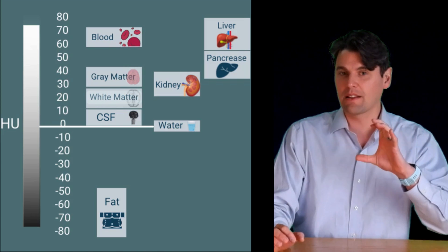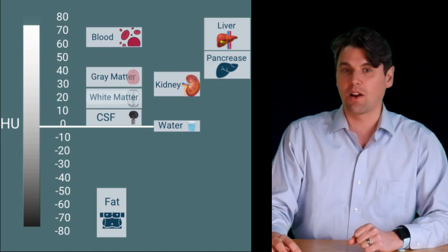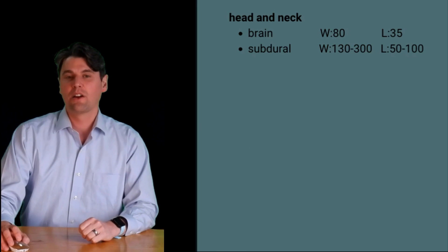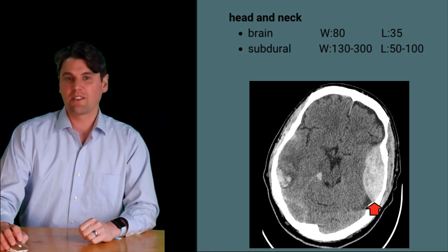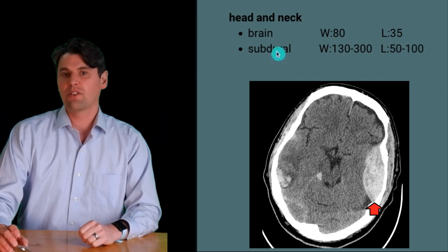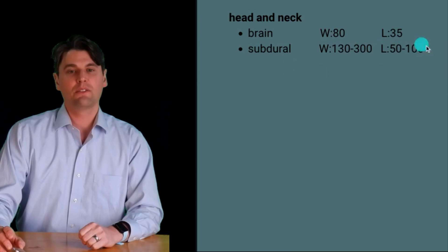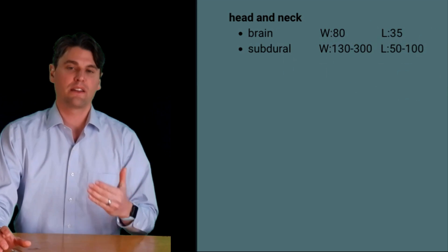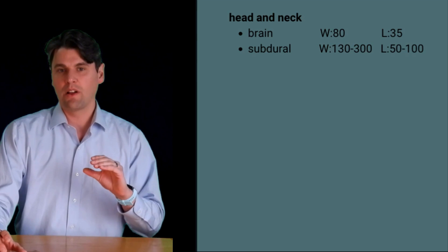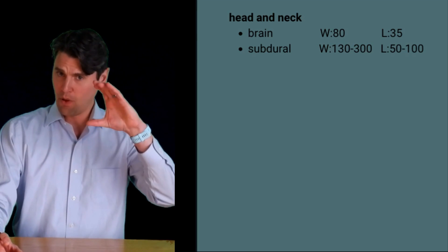You need a special window for imaging blood in the brain, especially if it's along the bone interface or right next to the calvarium, because you wouldn't want to confuse blood and bone when both are saturating out. This is called the subdural window — you make the window width wider and the window level higher in comparison with your standard brain image, so you can see blood next to the calvarium.